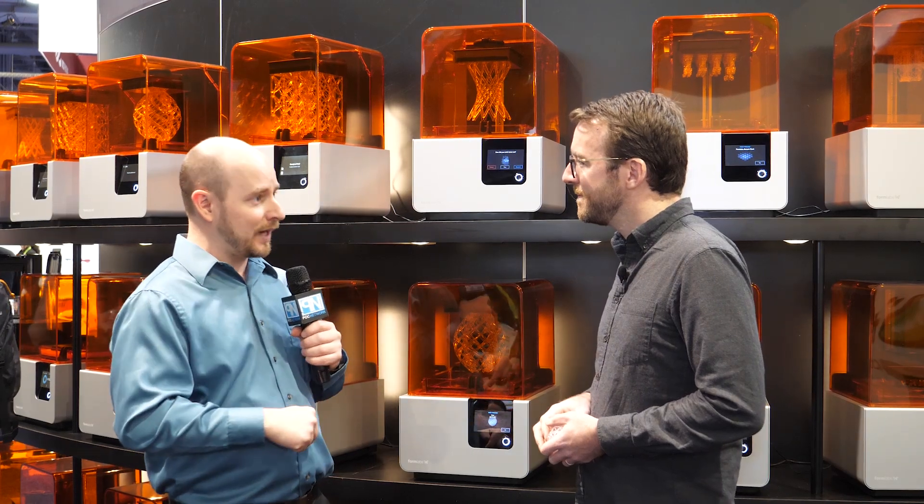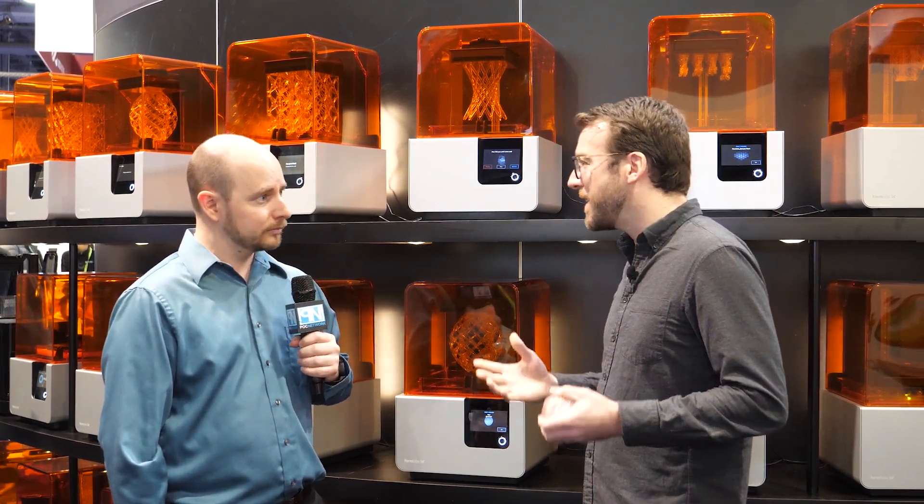You can buy one, network them all together and have them all print the same thing at the same time. But that's not what we're here for today — there's something different being announced. The big news at CES this year is a couple of new materials, and that's really been the big progress at Formlabs. They now have 19 different materials that support all kinds of workflows, so every time a new material comes out, some kind of workflow that hasn't been digital before can become digital — using CAD software to design something and 3D printers to print it.